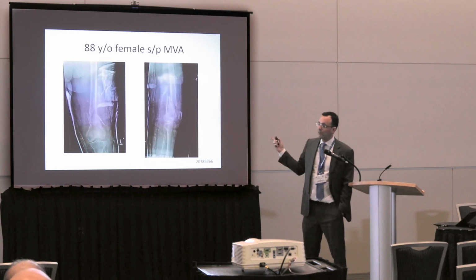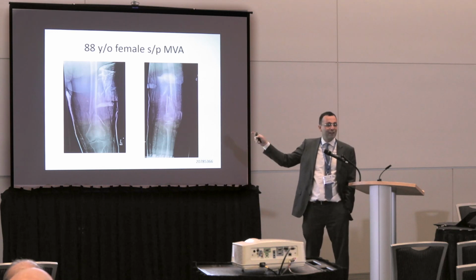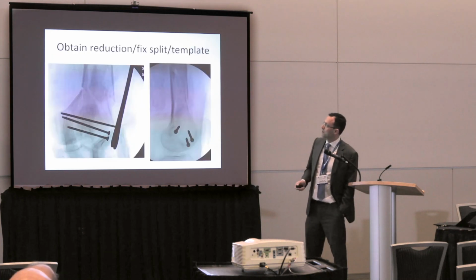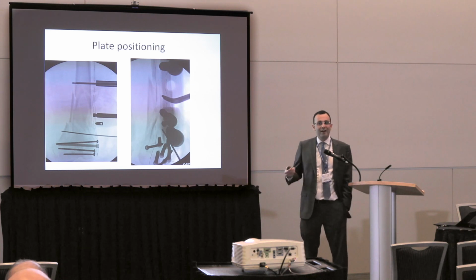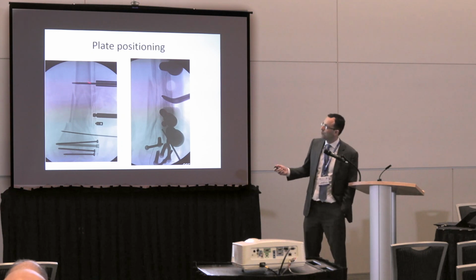I want to go through, and just for full disclosure, that specific patient was really old, and she passed away from something else. So I don't have many post-ops on her, but I do have many years of these other cases. So the 88-year-old patient, MVA, similar story, right? Intercondylar split. Here we go again. Obtaining reduction, making the box. Now this device, does this look familiar to you guys? The Whirlybird, I don't know if that's actually the official name, but I think this set has a Whirlybird type device. So again, everything you're used to, right? This quick brings that together really closely. You can do everything you're typically used to doing with this.